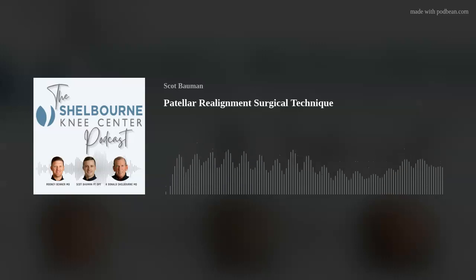I also like to keep my osteotomy thick. I did a paper when I was a fellow about tibial tubercle osteotomies and total knee replacements, and one of the technical pearls that Dr. Leo Whiteside, who's a legend of joint replacement, talked about was keeping a thicker osteotomy of about a centimeter thick and a longer osteotomy in total knees. He would do one that was 6 to 8 centimeters long. I don't know that you necessarily need 8 centimeters, but I usually try to get 5 or 6 centimeters of the tibial tubercle osteotomy, so you have a broad area of cancellous bone for fixation, and I feel like that's been a good innovation for me as well.